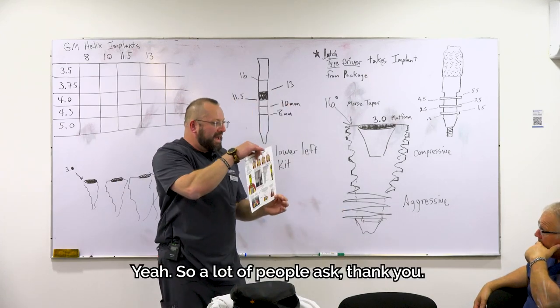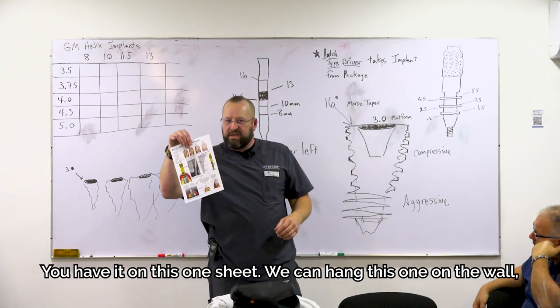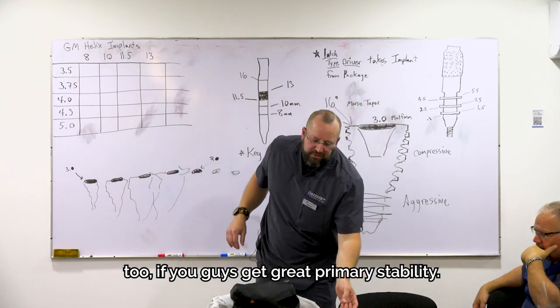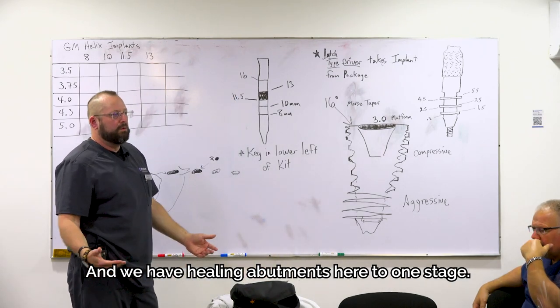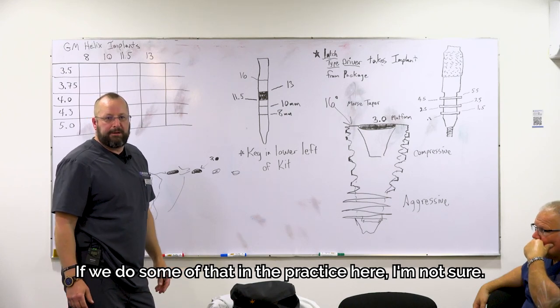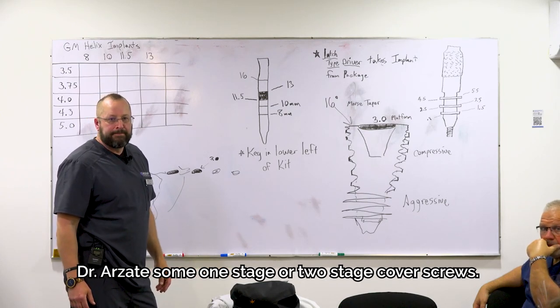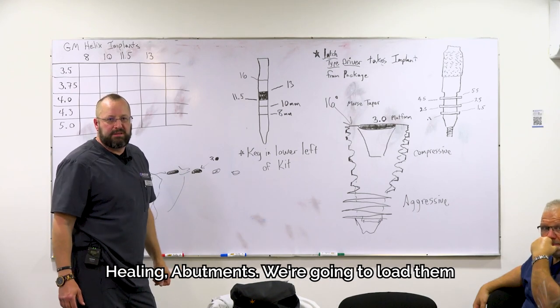Yeah, so a lot of people ask, thank you. A lot of people ask, what are those lines that are on there? You have it on this one sheet. We can hang this one on the wall too if you guys get great primary stability, and we have healing abutments here to one stage if we do some of that in the practice here. I'm not sure, Dr. Azadi. Right. Some one stage or two stage cover screws, healing abutments.